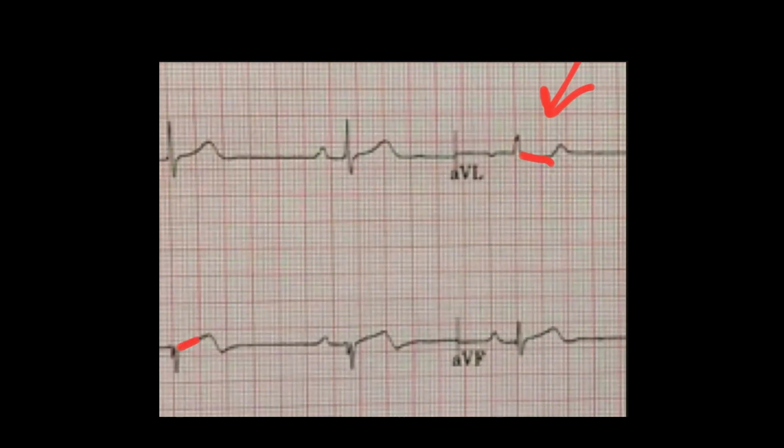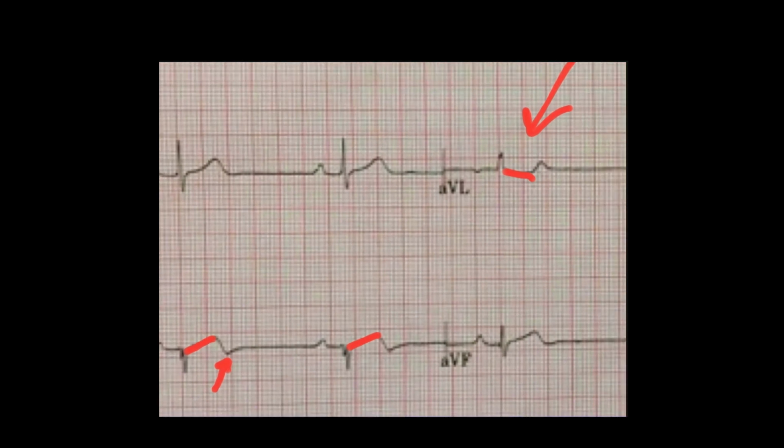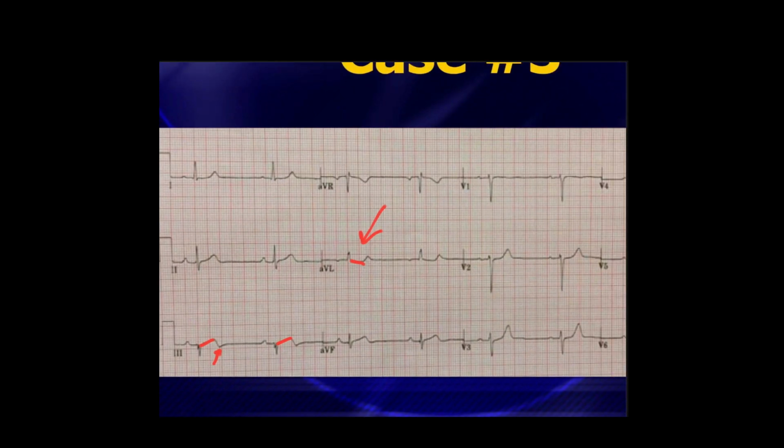The other clue here, by the way, as we talked about last week, is to take a look at how straight the initial part of that T-wave is. That is not normal. And there's also kind of a Wellens type of appearance, or biphasic T-wave appearance, in lead 3. Now, that's not called Wellens, because Wellens talked about biphasic T-waves in the mid-precordial leads.